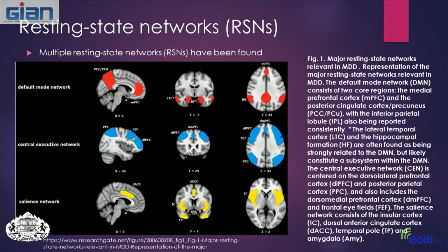So as people looked a little bit more into this, you can pick a seed region of the brain and take this up and down oscillation, and you can correlate all the other regions of the brain to it. So you were looking at dependencies that are locked together during time. They're moving up and down together over time. And what they found were these different resting state networks.